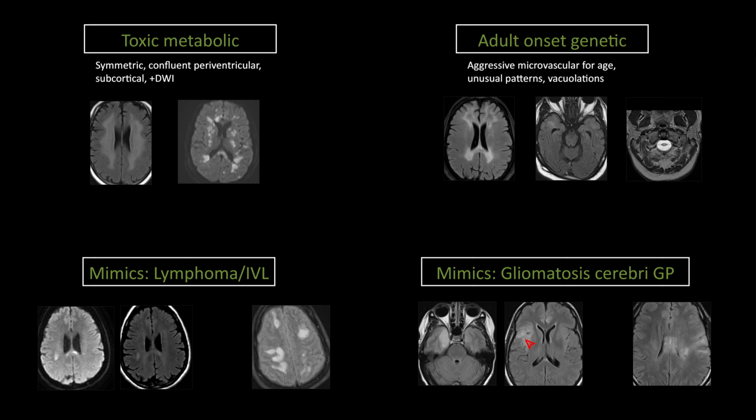We showed a case where it was pretty much identical to autoimmune encephalitis, and this other case that was more asymmetric and unilateral, having a big white matter propensity for extension along white matter tracts, but not with a lot of swelling or mass-like nature, but also turned out to be glioma.